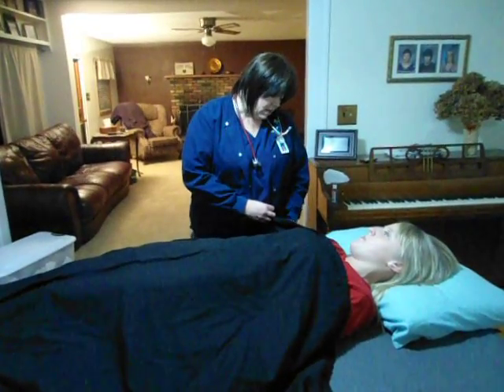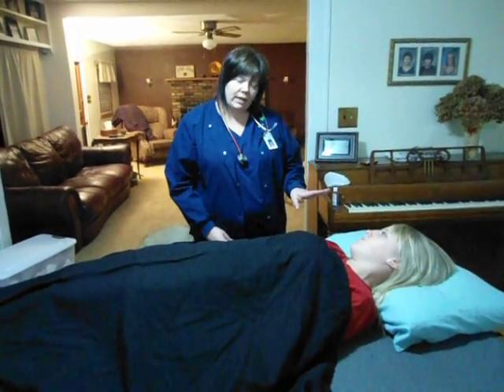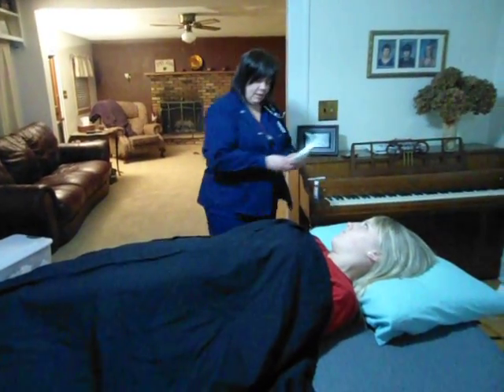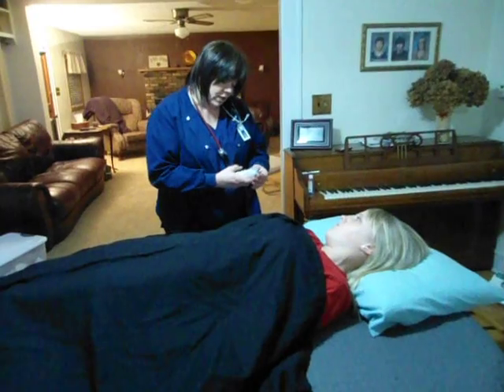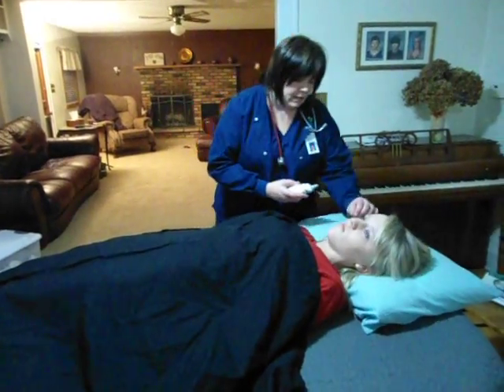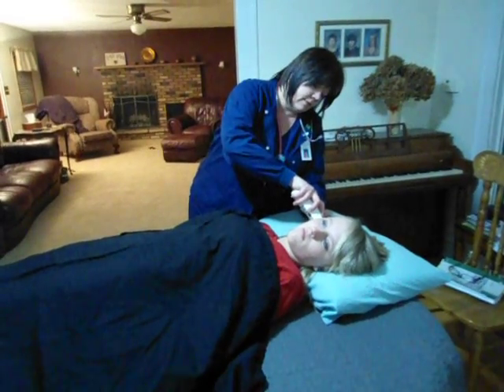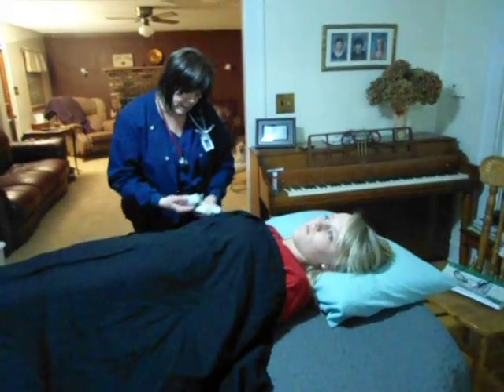And then, I've already gotten the height and the weight, and I'm going to check your temperature. I'm going to do it tympanically. Okay.